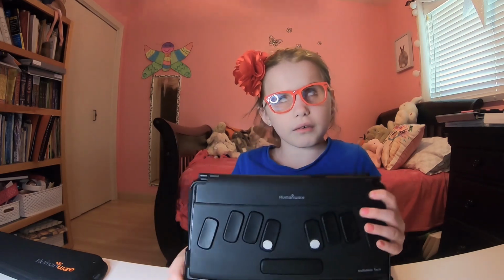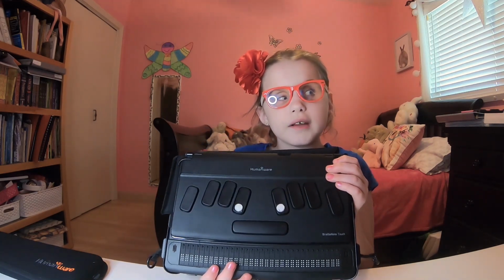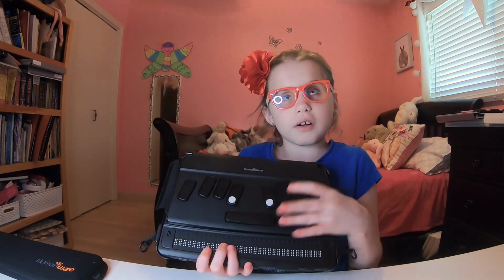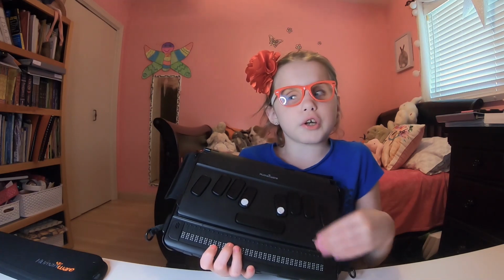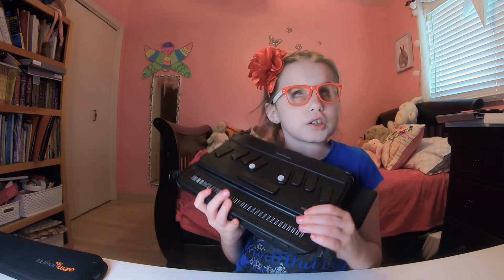So we've got our keypad: 1, 2, 3, 4, 5, 6, dot 7 and 8, which are enter and backspace. You have your typical space bar, your long, computer-ish space bar. It feels like a computer space bar. That's the only way to describe it. And you've got your cursor routing buttons.